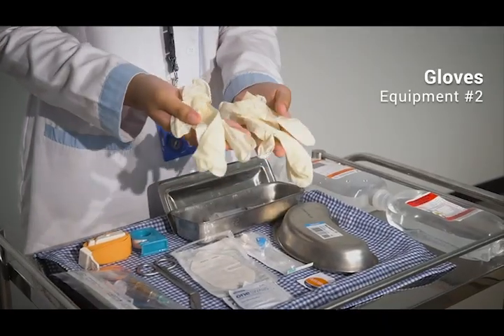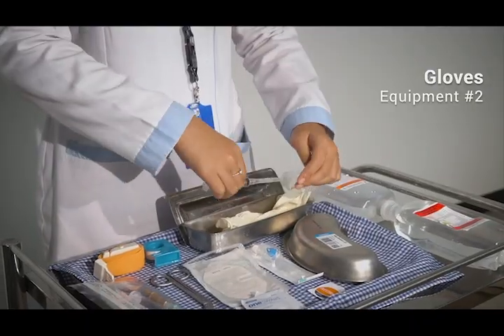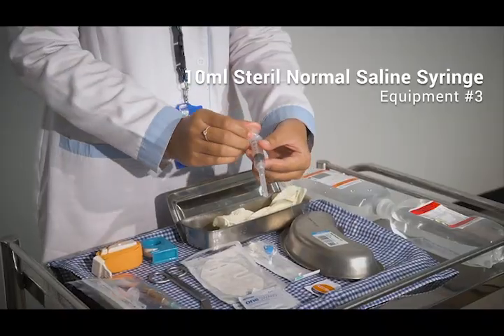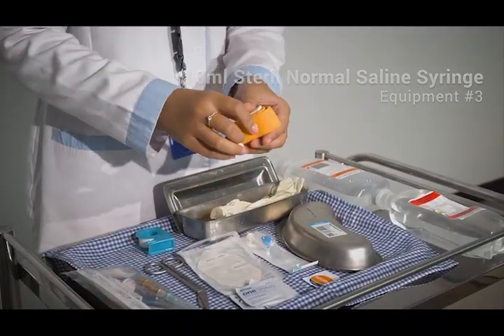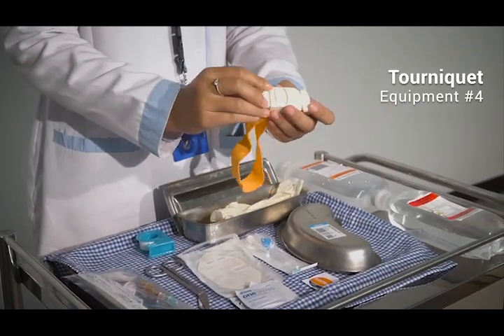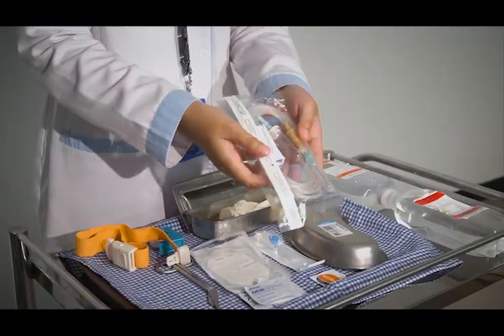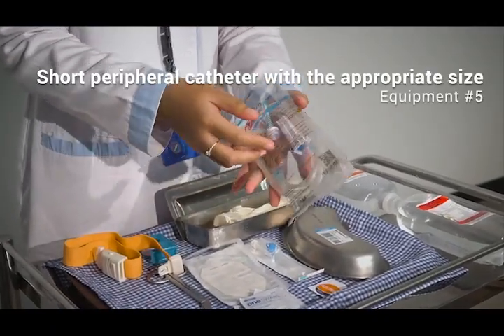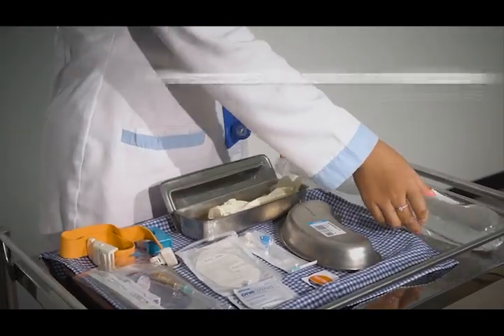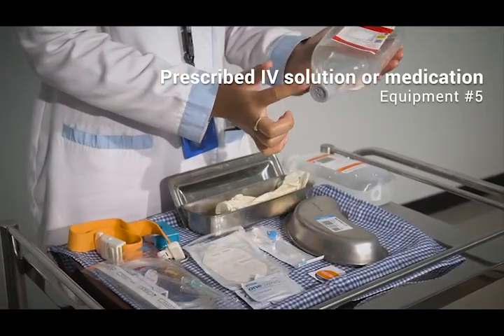Gloves: syringe containing sterile normal saline. Tourniquet: short peripheral catheter with the appropriate size. Prescribed IV solution or medication with a tag and primed administration set.